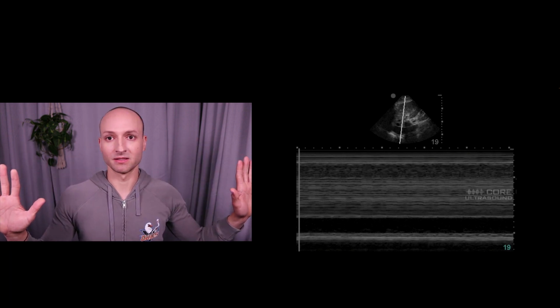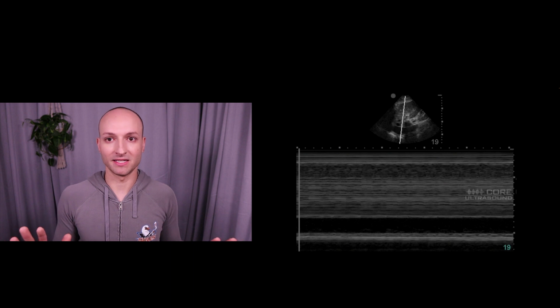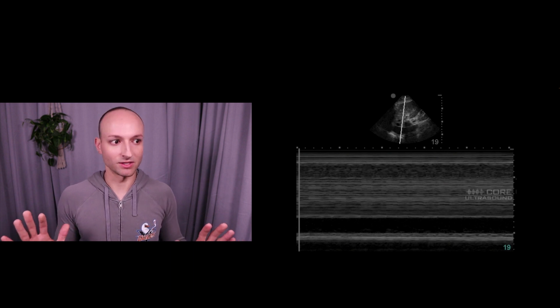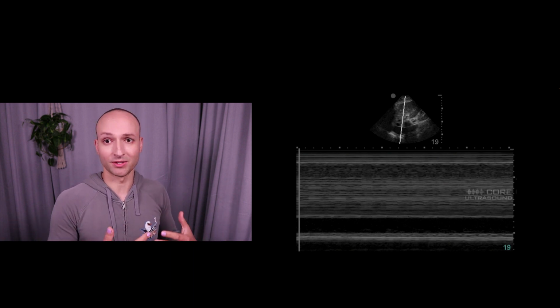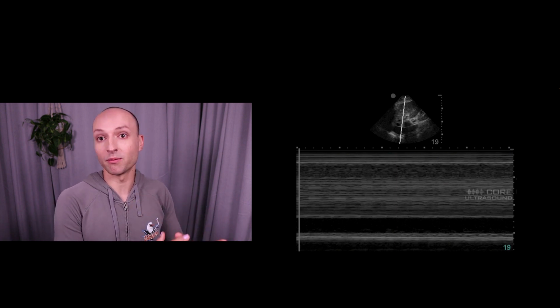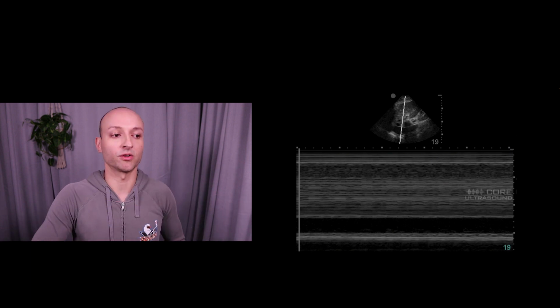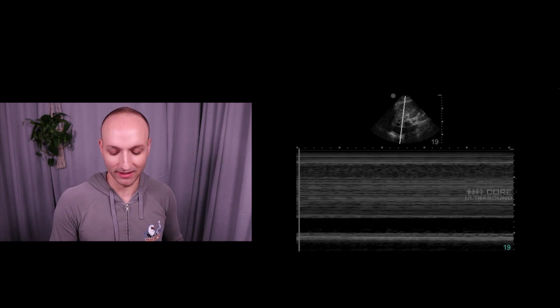I don't ever want to see this, ladies and gentlemen. I never want to see anybody measuring the IVC on M mode. It's just ridiculous to do this. In a lot of studies, I'm reading these articles and seeing that they're using M mode, and respectfully, this is not the right way to measure. The reason is the IVC itself can move in the cranial-caudal direction pretty significantly, actually.